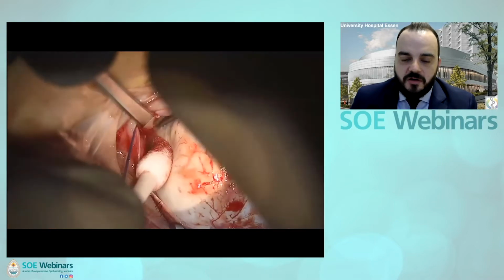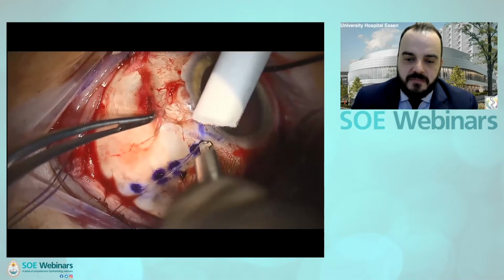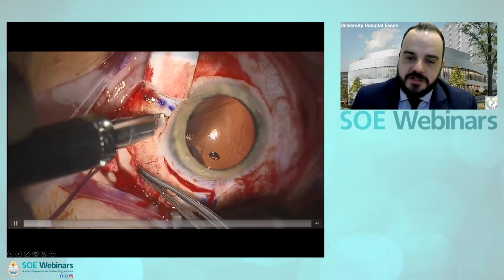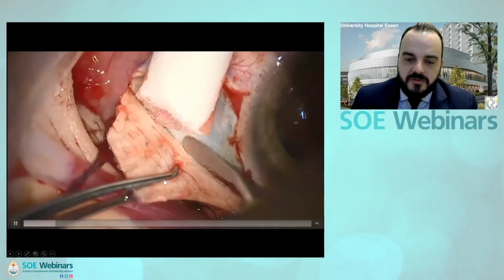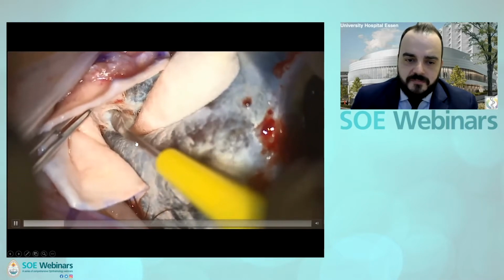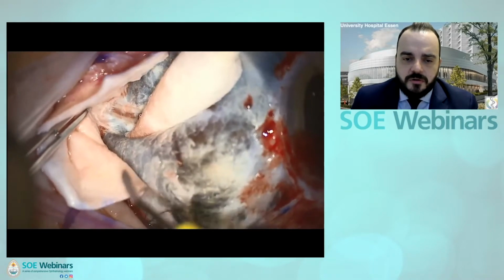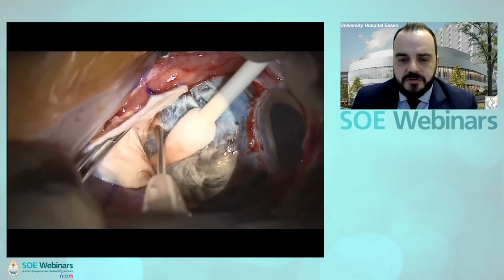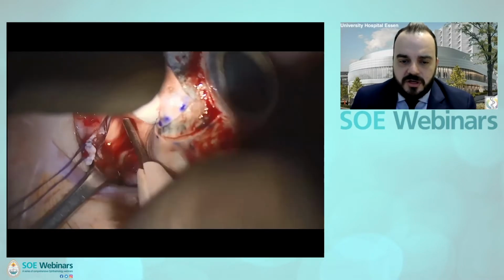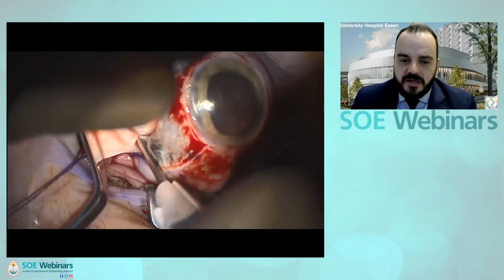If a muscle is over the tumor, we need to remove the muscle, find the vortex veins, cauterize them, mark the tumor with the marker here, and then cut the anterior edges around, then preparing the flap. You can see here a ciliary artery and a ciliary nerve. We will cauterize the artery in order to reduce the bleeding. Afterwards, we always perform an anterior vitrectomy to have the eye hypotonic. It's much easier to prepare the flap when the eye is hypotonic.